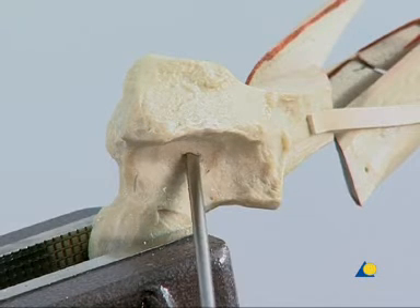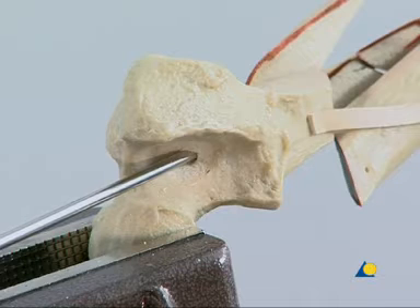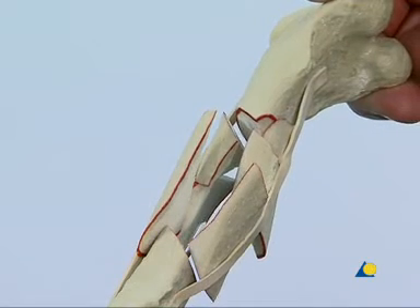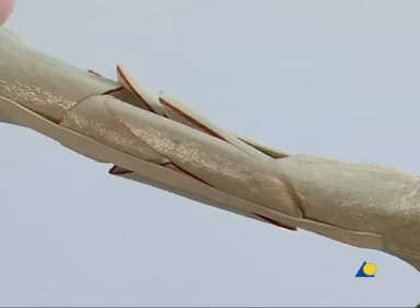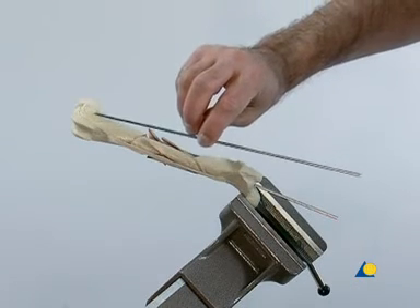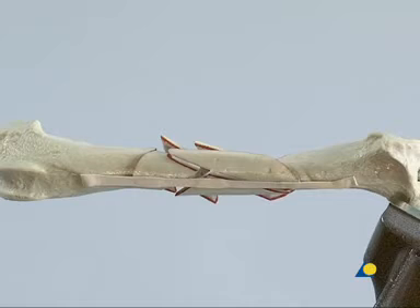To avoid slippage, the tip of the pin is first seated into the metaphyseal bone in a cranial direction. Once the tip starts penetrating the bone, the pin is directed towards the patellar region and driven distally. The pin crosses the comminuted area and engages the distal segment. There will be increased resistance when the pin hits the distal metaphyseal region and the bone will be distracted to restore normal length. To check the depth of penetration, another pin of the same length is held alongside the visible portion of the pin that protrudes from the bone. The end of the pin should lie at the level of the proximal extent of the trochlear sulcus and must not penetrate the articular surface. The spatial alignment of the landmarks is checked to assess the axial length and the rotational alignment of the joints above and below the fracture.